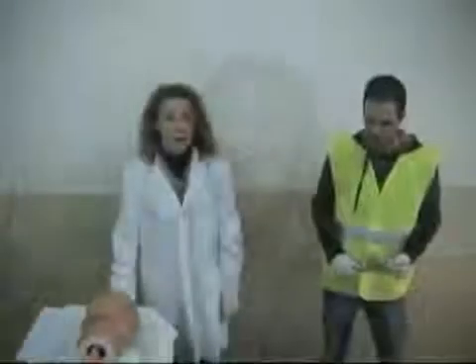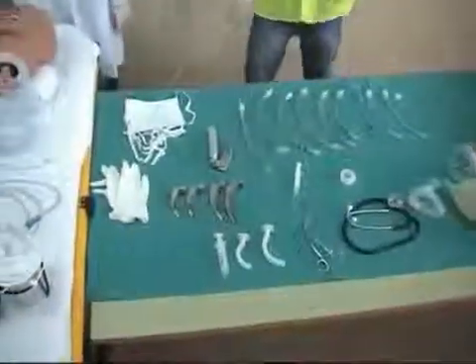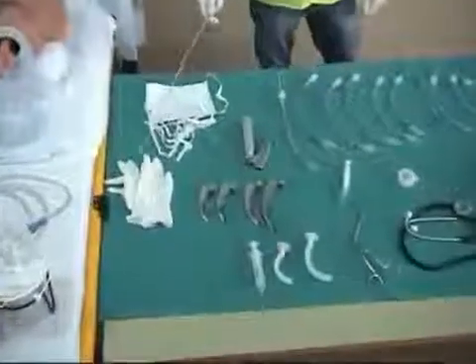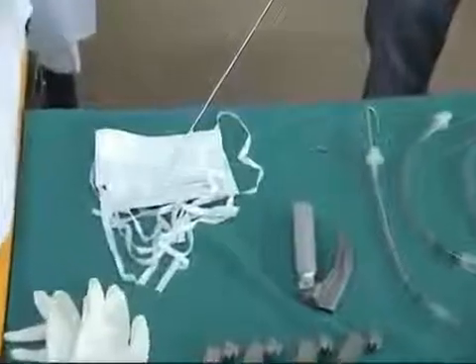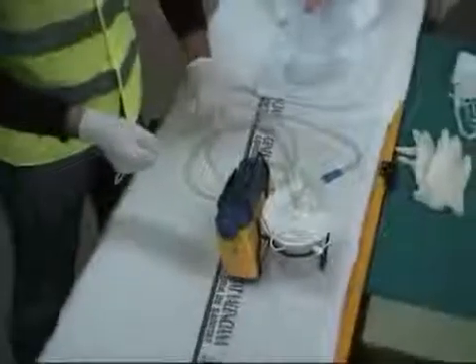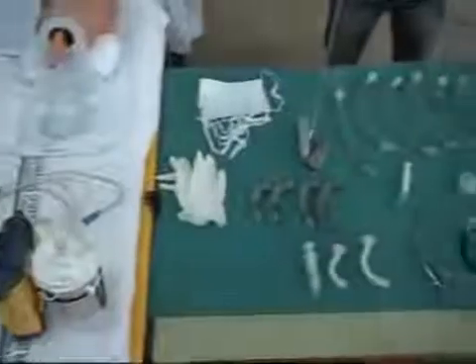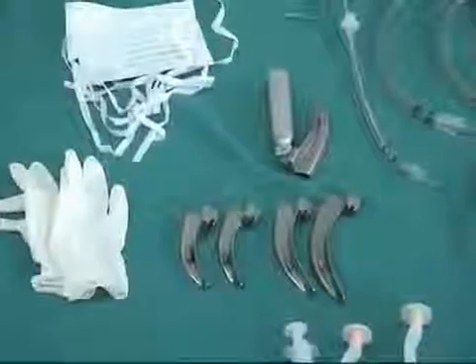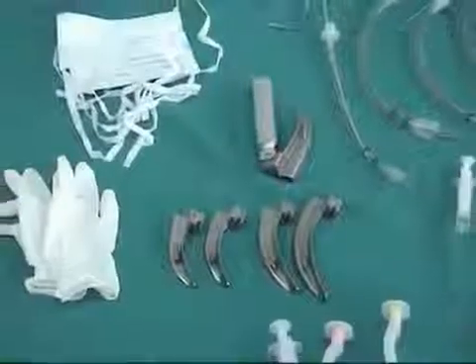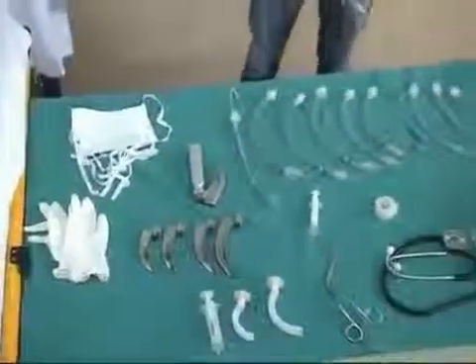The first step is to gather the required equipment, which is the following: gloves, protective face shield or at least a facial mask, a working suction system, a laryngoscope with appropriate blade. There are two main sorts of blades, curved and straight. In this case, we are going to use a curved blade. Endotracheal tube with a stylet.